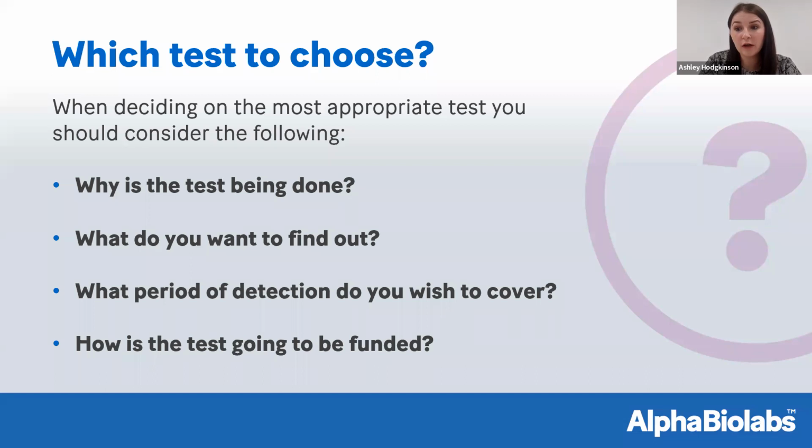What time frame you want to cover, that's really important so that we can check with your client that they have a suitable sample, and if not, discuss options with you. And then how is your testing going to be funded? So all of these things need to be taken into consideration. And these are things that you can discuss with us over the telephone or via email so that we can help you make the best decision for you and your client.